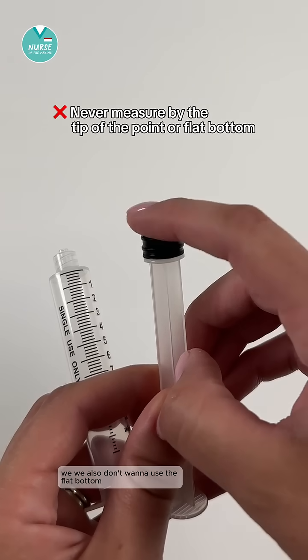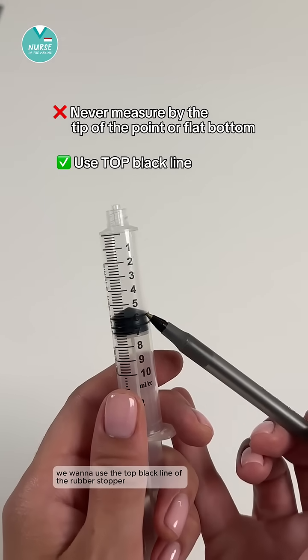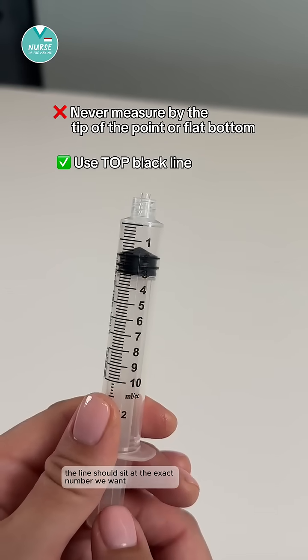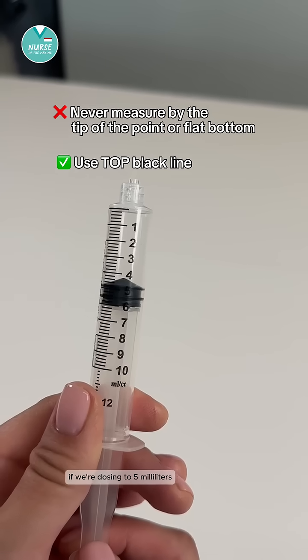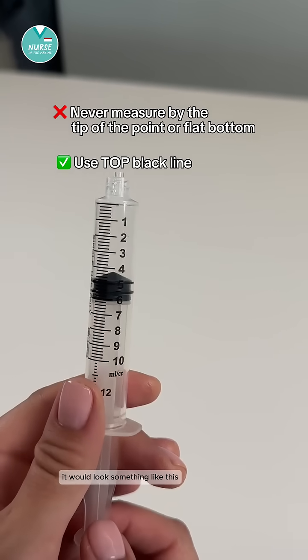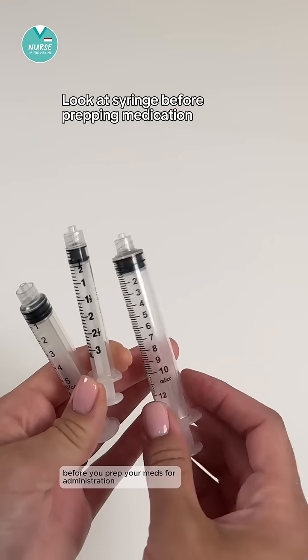We never want to measure the medication based on the tip of the rubber stopper's point, and we also don't want to use the flat bottom as the indicator. We want to use the top black line of the rubber stopper, so when we pull it back the line should sit at the exact number we want. If we're dosing to five milliliters, it would look something like this.